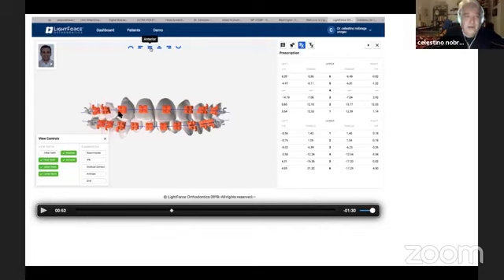Here I have the situation where this canine is going to be reshaped into a lateral, but the root is a canine root. So I have the bracket for this crown, but for placing that root as a lateral, because this setup was oriented by CBCT. So this is the goal.